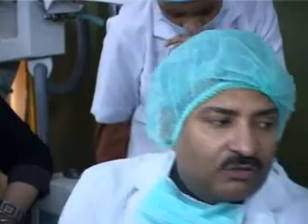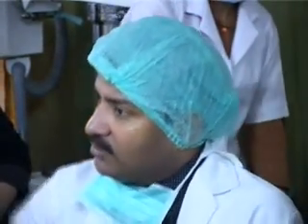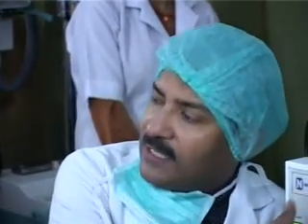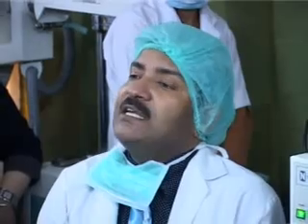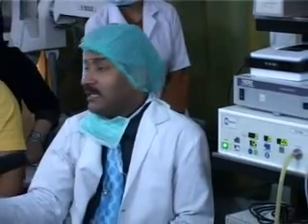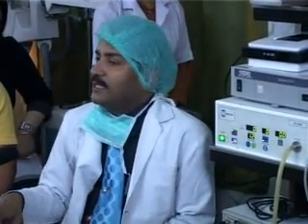How much capacity does this insufflator have and how do you know? You can know immediately. You disconnect it and switch it on with maximum flow rate. You will see this flow rate going. This is an 18 liter insufflator. This insufflator is only 18 liter capacity. So if you have a bigger one, 30 liter, then it will show you 30 liter also. So the actual pressure will be seen.